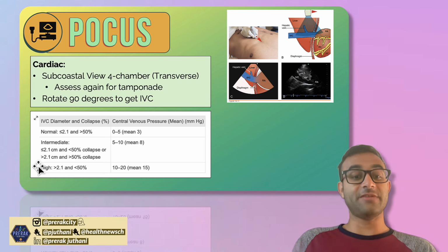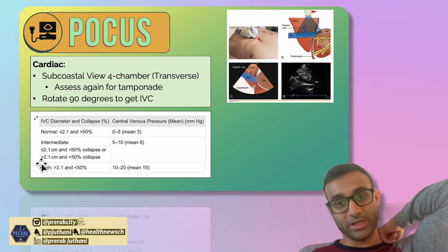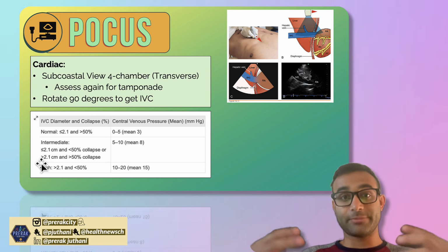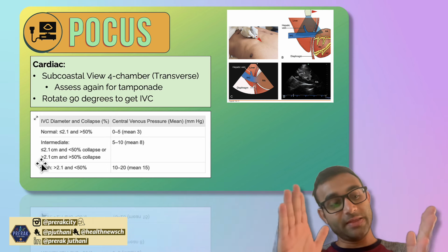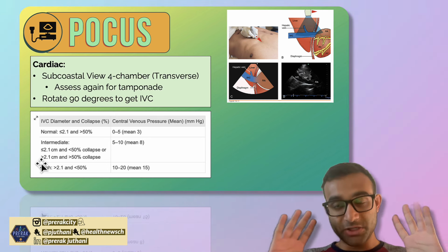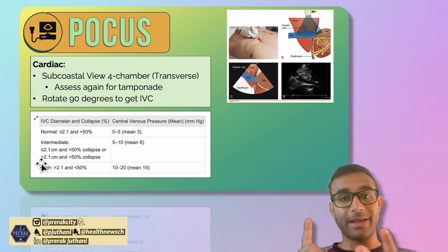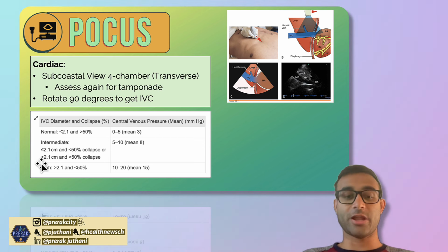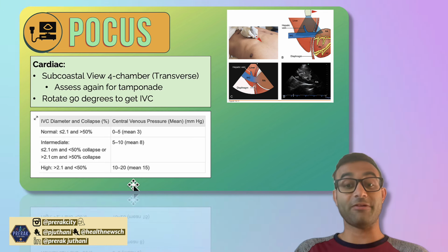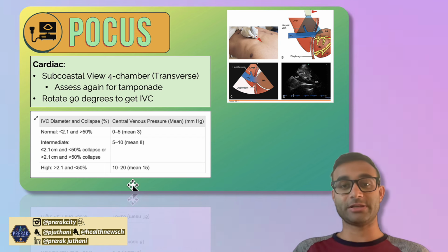If the inferior vena cava is really massive, let's say 3 centimeters, and usually when someone takes a deep breath in, they decrease the intrathoracic pressure because your lungs are expanding, and usually the IVC should compress. But if it doesn't compress, that tells you the patient is so fluid up that their IVC is plump and not varying with respiratory variation. So I like to use that as a way to think, okay, someone may just have a very high central venous pressure, or they're volume up, and they might benefit from some diuresis.